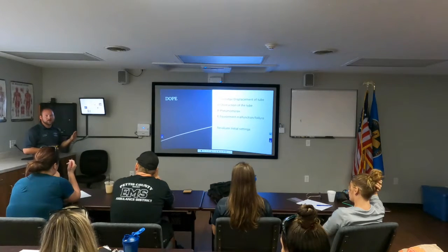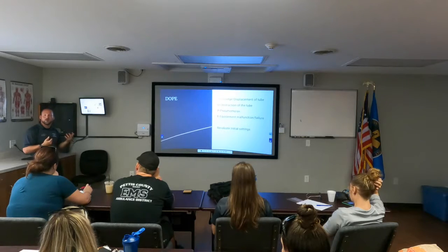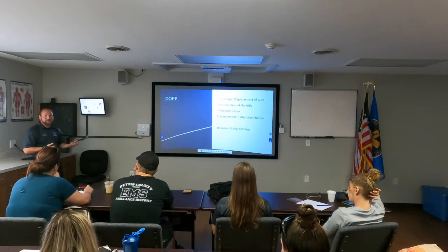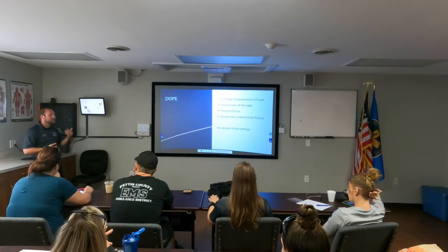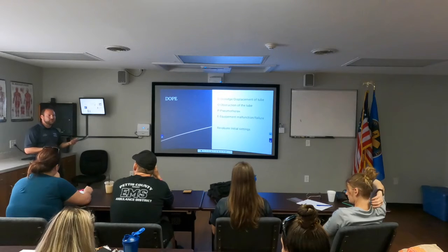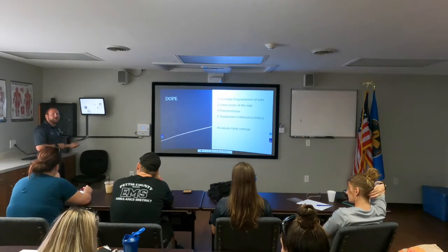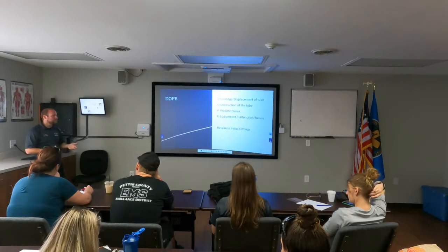Equipment failure is very frustrating in the aspect that if we have failure on that, it has to be taken out of service, reevaluated, and hopefully we can get it back in a timely manner. Sometimes it did crap out on it. Is the battery fully charged? We check it every day, it should be at 100%, to last 10 hours without being plugged in on its battery. So hopefully that never happens.